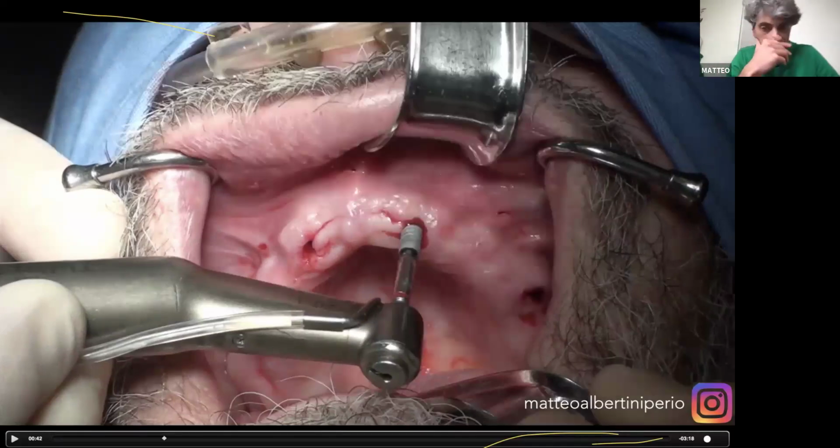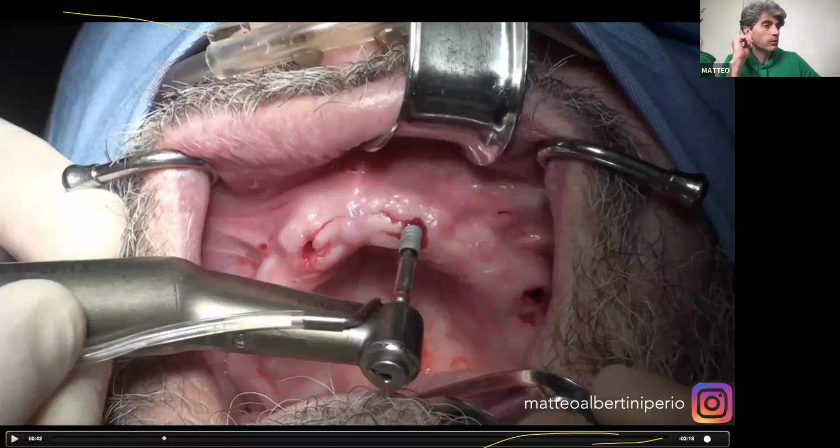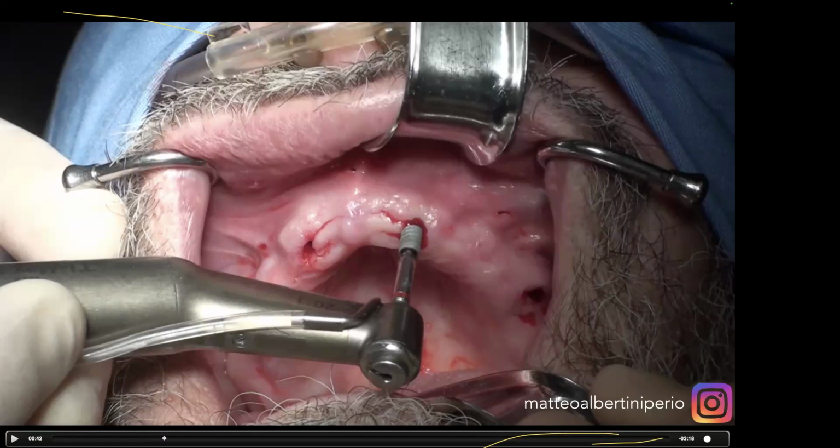And in these cases, we prefer to place the final position of the implant freehand, just to simplify a little bit the process, because in these cases we don't want to connect directly the prosthesis to the implant. Да, и здесь, поскольку мы не хотели напрямую соединять протез с имплантатами, мы решили, что установка имплантатов будет проведена не через шаблон, а вручную.